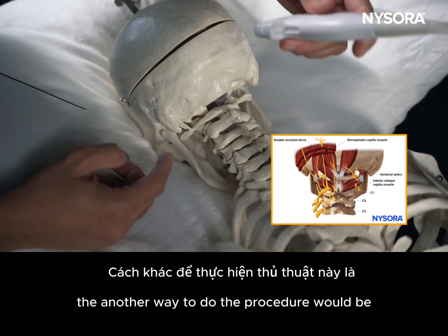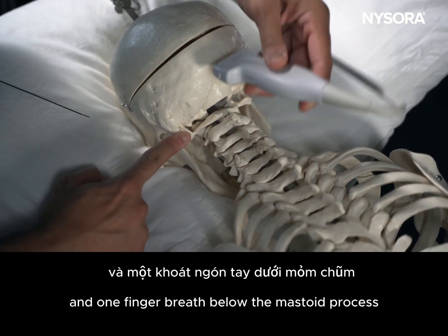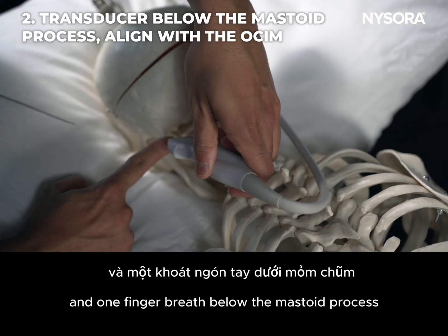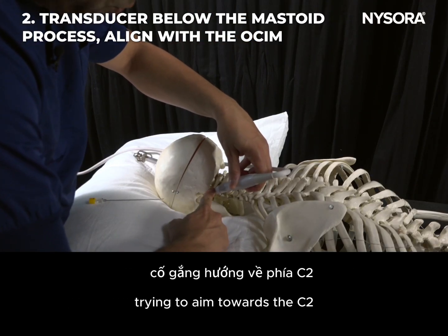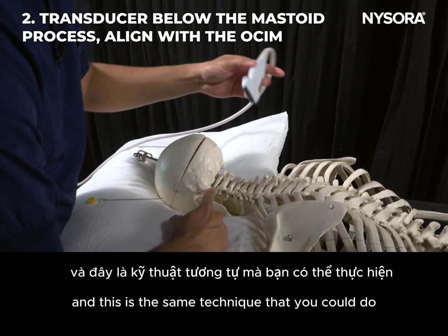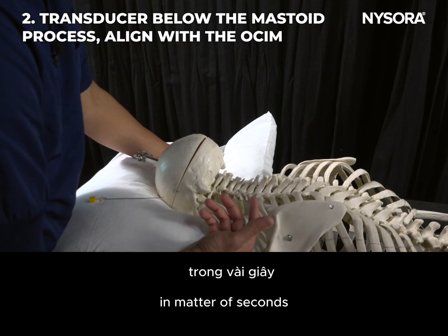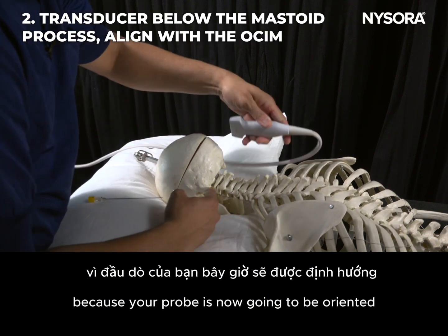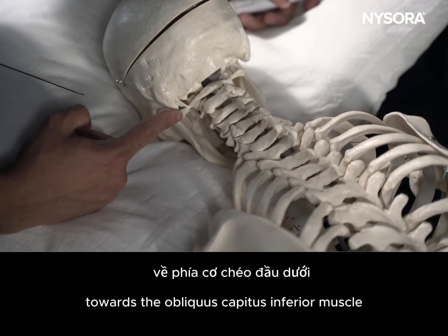The other way to do the procedure would be you feel for the mastoid process, and 1 finger breadth below the mastoid process you will position the ultrasound probe trying to aim towards the C2. And this is the same technique that you could do, with which we will be able to find the greater occipital nerve in a matter of seconds, because your probe is now going to be oriented towards the obliquus capitis inferior muscle.